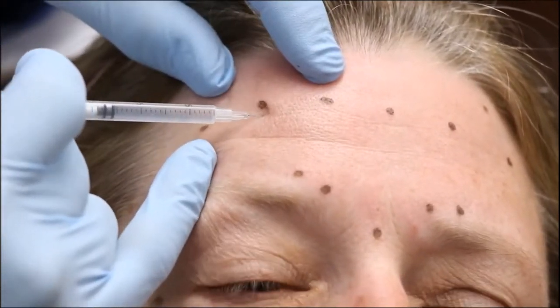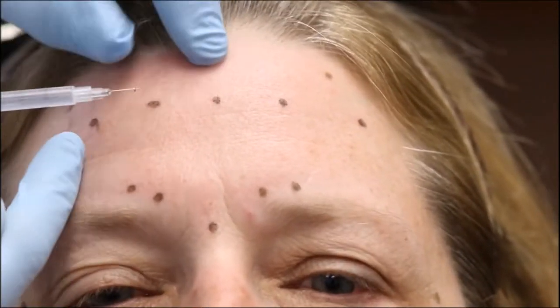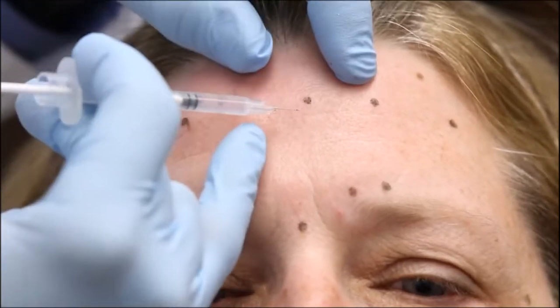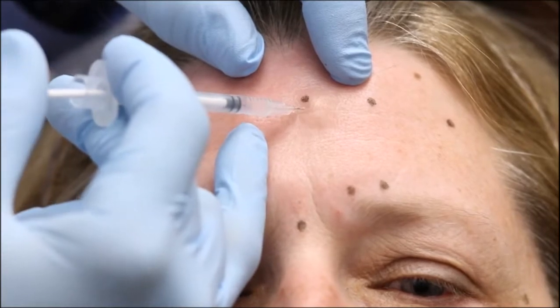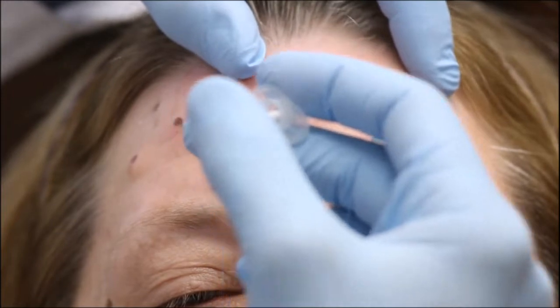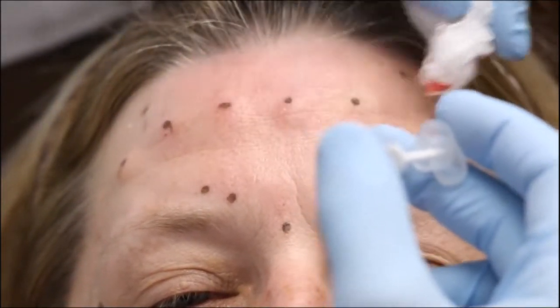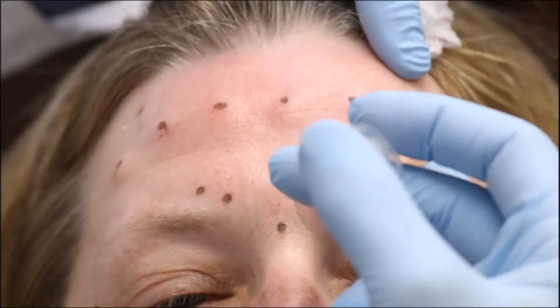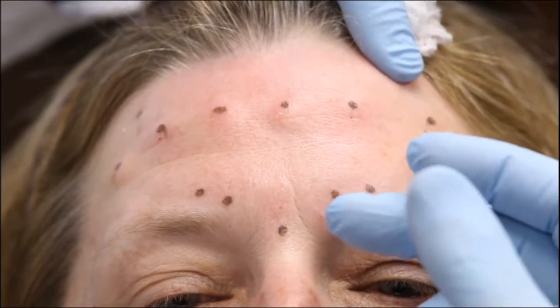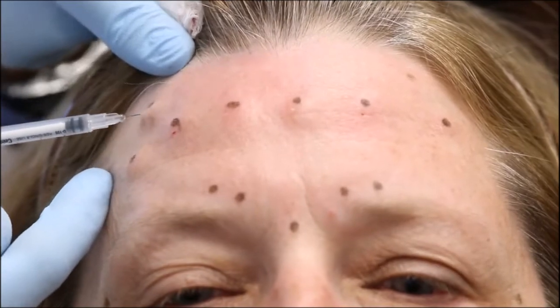We want to spread it out, and we're using ComforTox needles — these are the most comfortable needles on the market, they are 31-gauge. We use a lot of different syringes for these patients because we want a brand new needle tip for every single injection. We've spread this botulinum toxin nicely across.